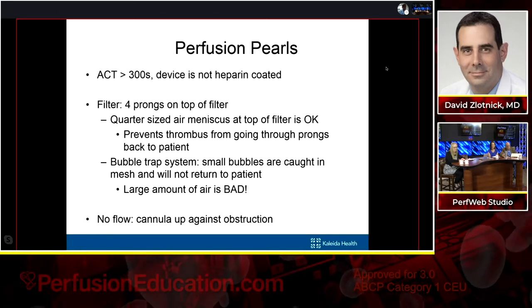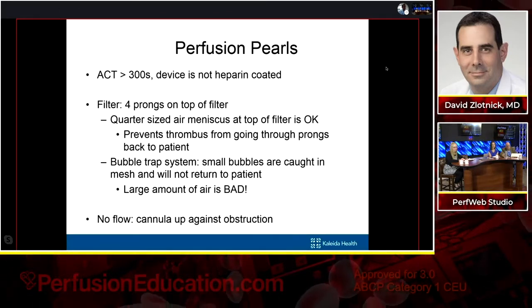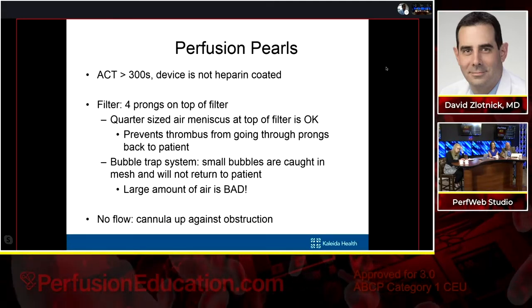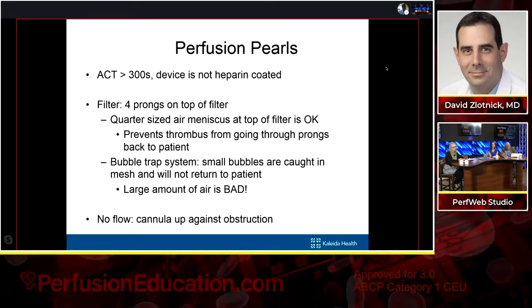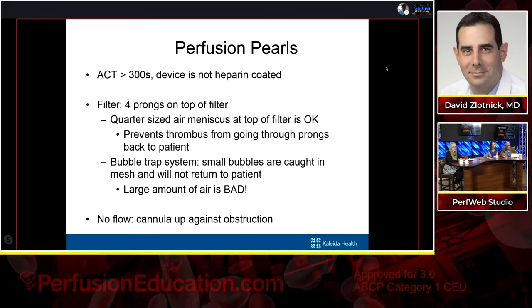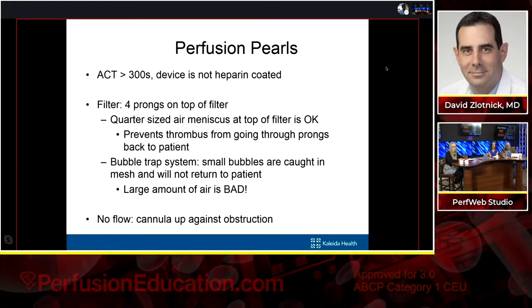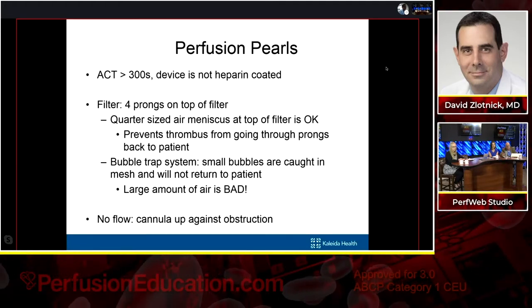And then the other thing is, if we're AngioVacing and we get no flow, that usually means that the cannula is up against an obstruction. And we'll go through certain cases of what we do in that situation. But it's not one of the things where we always want to turn the flows down. It's one of the things where we want to have a constant interaction and conversation with the physician who's utilizing the AngioVac, and our imaging people, the echocardiographer who's watching what we're doing.